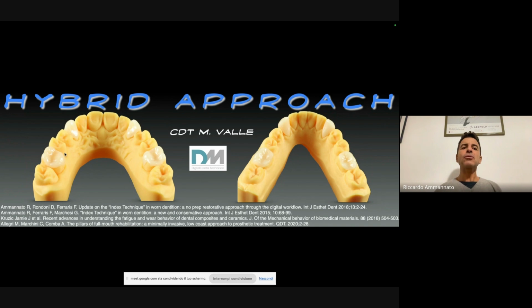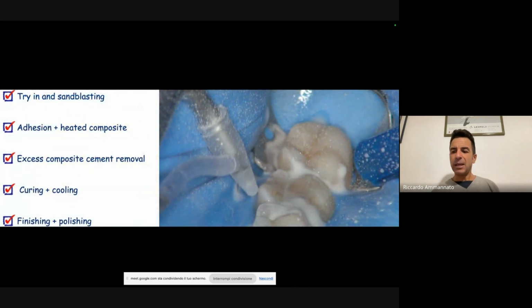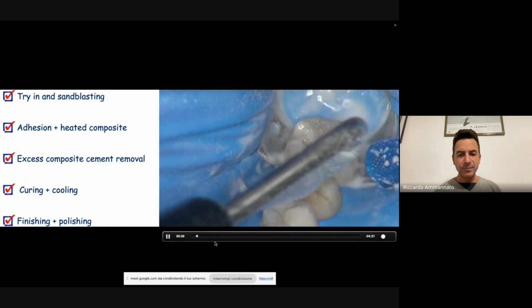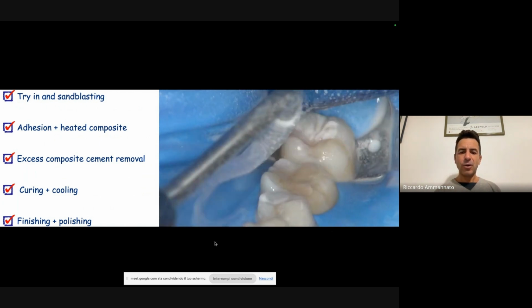And here I'm going to now cement. These are the two models, upper and lower, after I've molded the 20 teeth. And now I'm going to cement the four table legs, upper and lower, as you see here. So here, just two videos that are quite long, but I'm going to, let's say, cut them through the presentation. And the music, yes, is down, so you don't hear it, I hope.